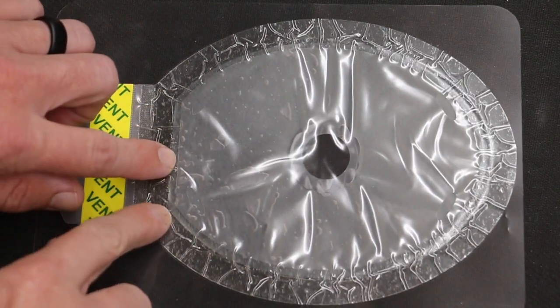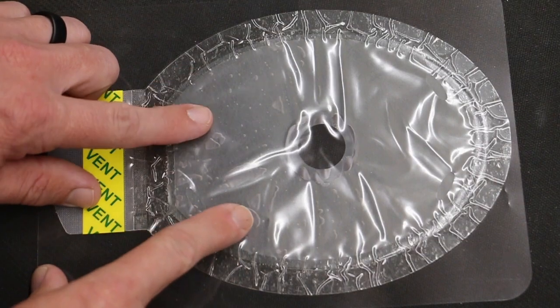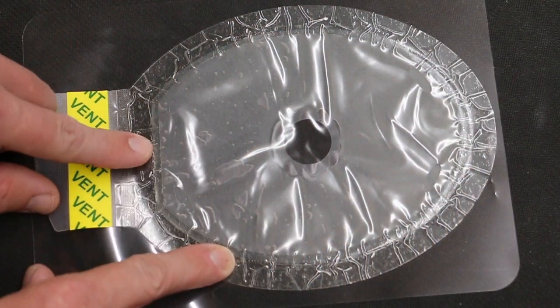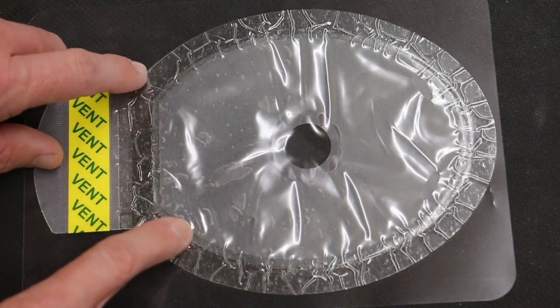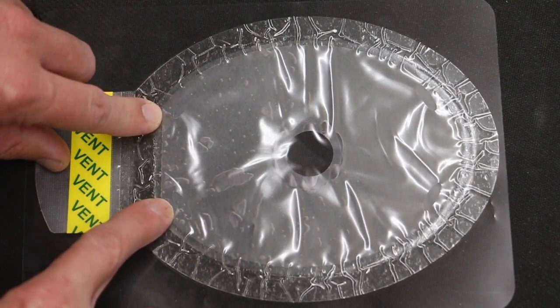So if we see on the outside of the edge here, we have an outer band of material, and it's a little bit different than the sticky material on the inside. So it's going to help make a better seal on the outside so that the chest seal will vent. The blood or air is going to come out of the hole here, and I hope you can pick it up on camera. Should be able to pick it up when we actually use it. You can see the little color change right there.